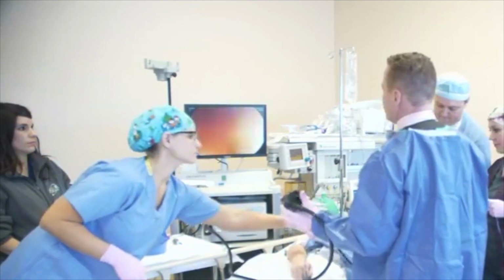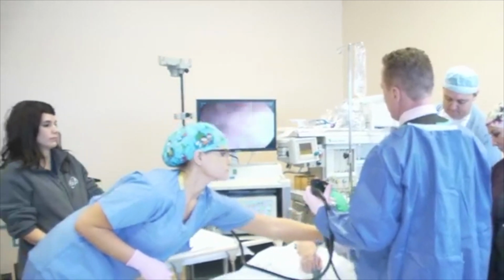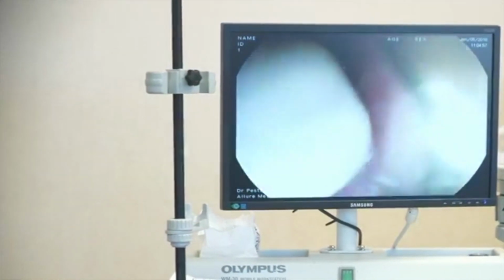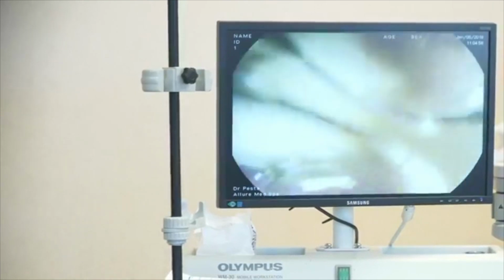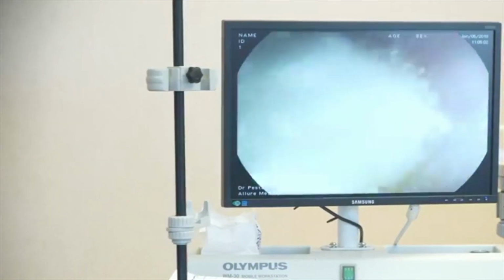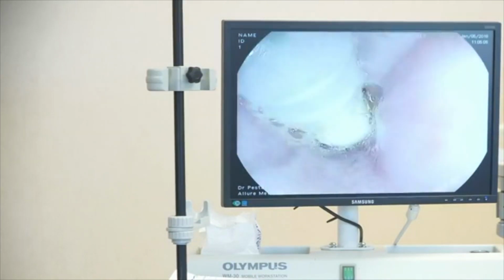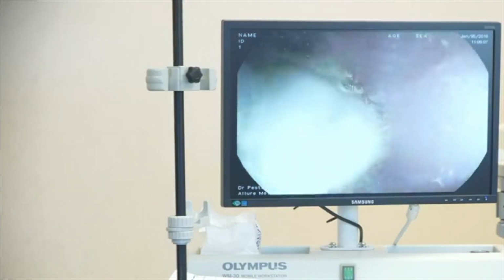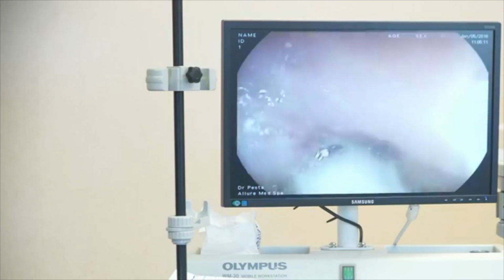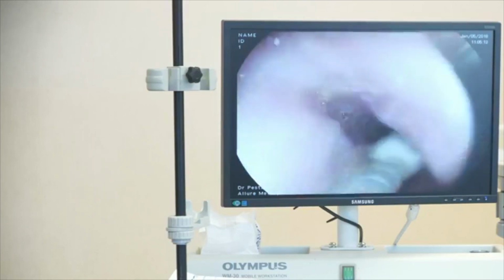And now if you can see on the monitor, we have the balloon partially down the esophagus. And now we're going to follow it into the stomach with the scope to be sure it gets into the right location. I think it's really important with these devices that you take a look inside the esophagus and the stomach. So it's nice that we can do an endoscopy prior to the procedure to make sure that everything is clear and ready for the balloon to go into place.